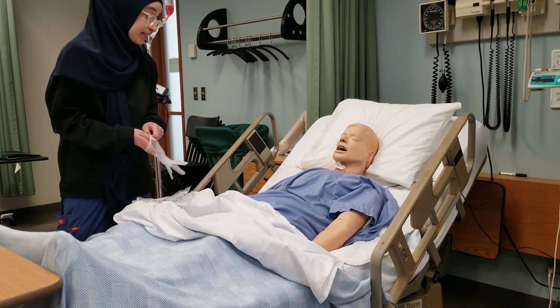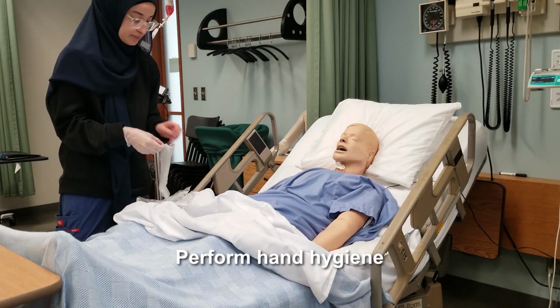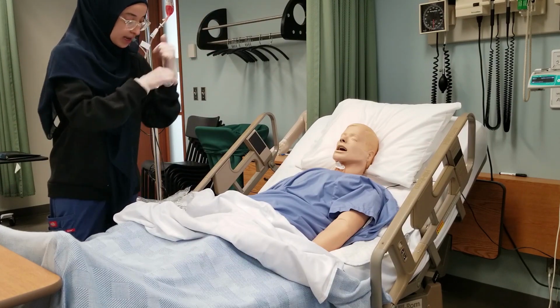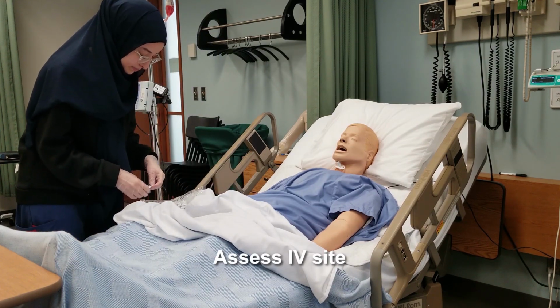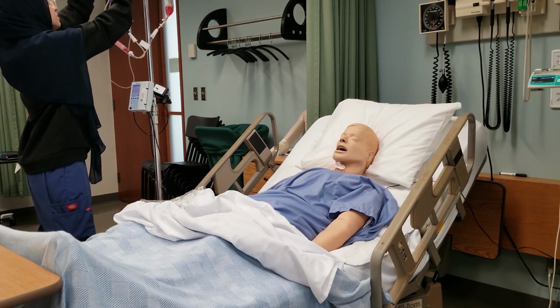Just put on my gloves. I already did my hand hygiene a second ago. I'm just going to assess your IV site super quick. Looks good. Okay. I'm going to load our set in first.